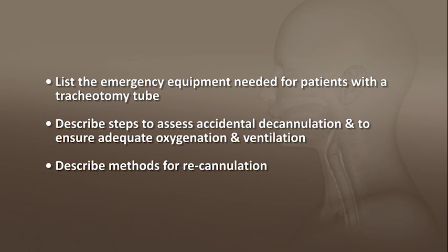In this module, we provided an overview about the importance of identifying patients at risk for accidental decannulation, how to assess patients for suspected decannulation, and how to reinsert a tracheotomy tube.